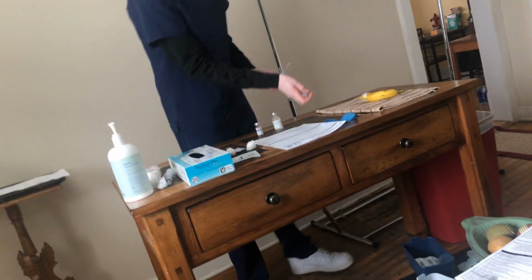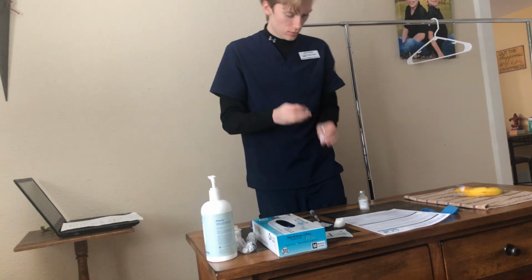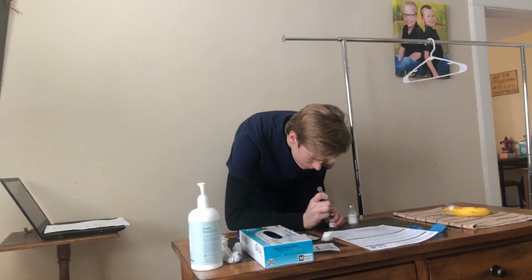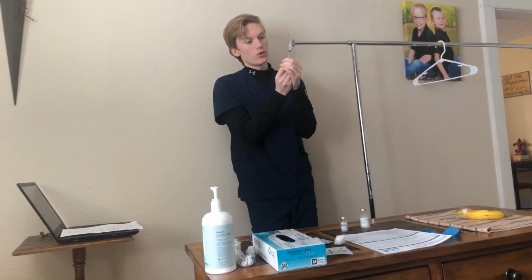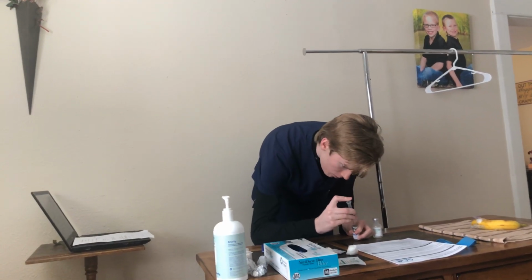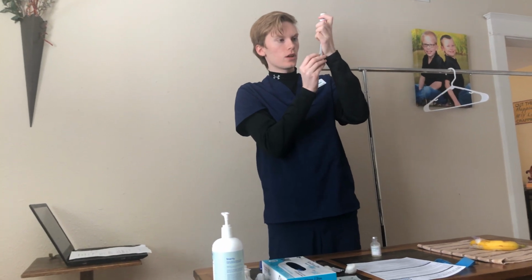Alright, discard these in the sharps container, where all sharp things go. Clean off the top of my medication first. Now that that's done, remove this, bevel up. Oop, not just yet, I forgot. Gotta draw back 3 mil, 1 mil of air. Yep, there we go. Then bevel up, inject, shoot in the 1 mil of air, flip it. Draw back the 1 mil of medication.